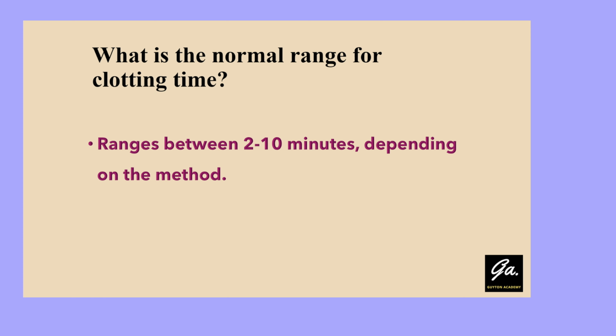What is the normal range for clotting time? The normal range is about 2 to 10 minutes, depending on the method. Sometimes the puncture is larger, so it will take more time, but it will be between 2 to 10 minutes.